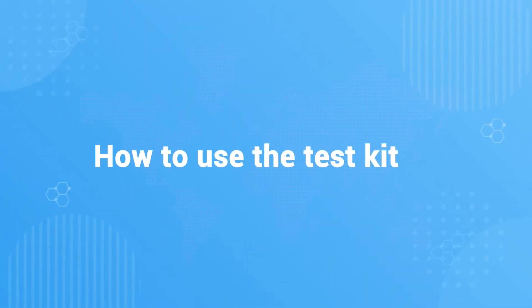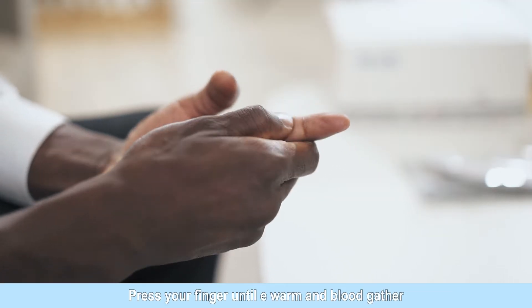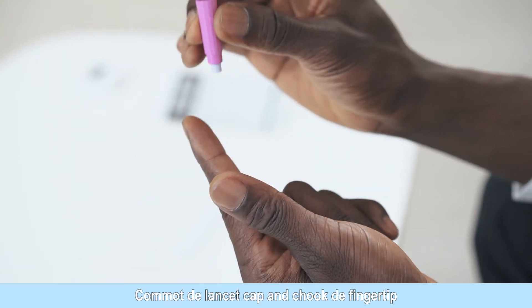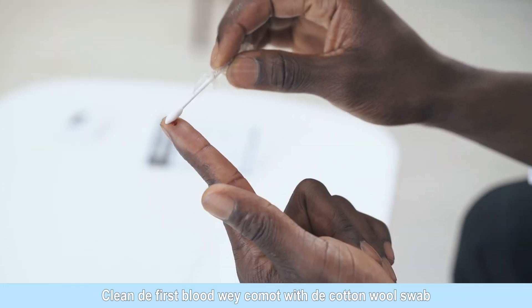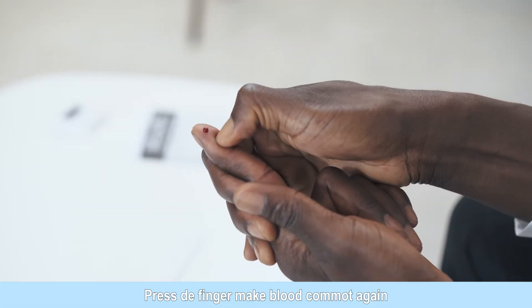How to use the test kit? Wash your hands and dry them before testing. Squeeze finger until warm. Open the alcohol prep pad. Clean the finger with alcohol prep pad. Take off the lancet cap and prick the fingertip by pushing against it. Wipe off the first drop of blood with a cotton swab. Squeeze the finger to create a full drop of blood.